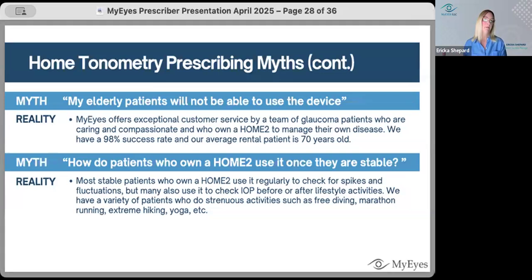I've been on a host of different steroids. I'm not a responder, thankfully, but I'm able to monitor that throughout any type of treatment that I've had. And with the Ozurdex, the same way, I'm able to monitor the minute I feel something. I'm probably not as compliant as I could be. I don't take it every day, but I know when I need to.